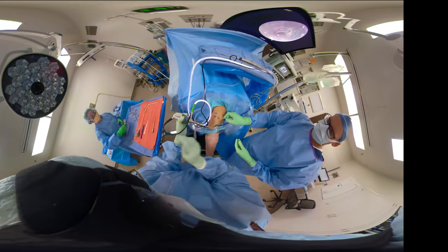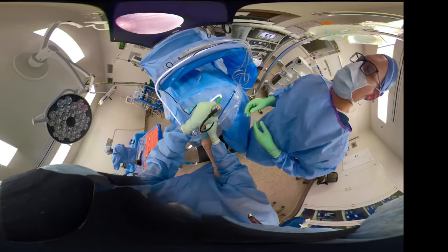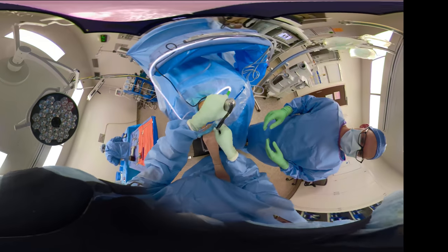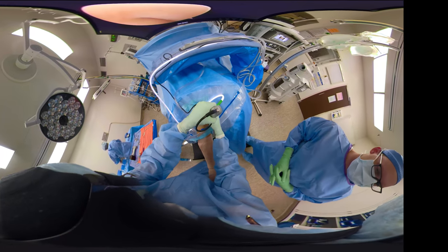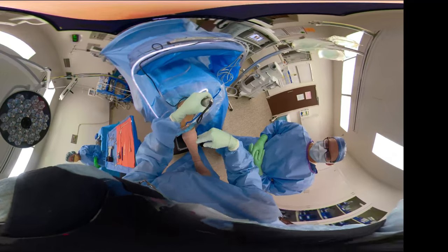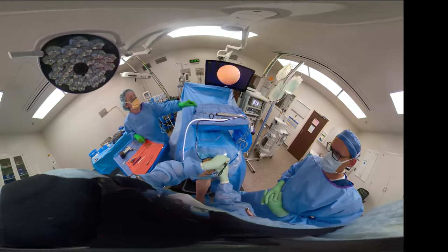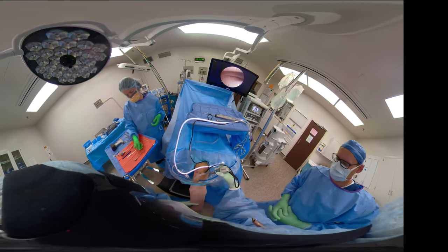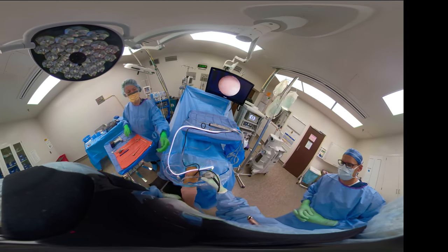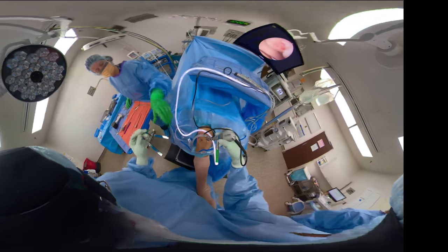So now we are putting the scope medial because we're doing the work in the lateral compartment, so we have switched our scope to the original working portal. Put it in with a cannula and then put the scope in. And now through that lateral portal, we can do our work. However, we're going to do a microfracture, so we will triangulate to see how we're going to get our drill.